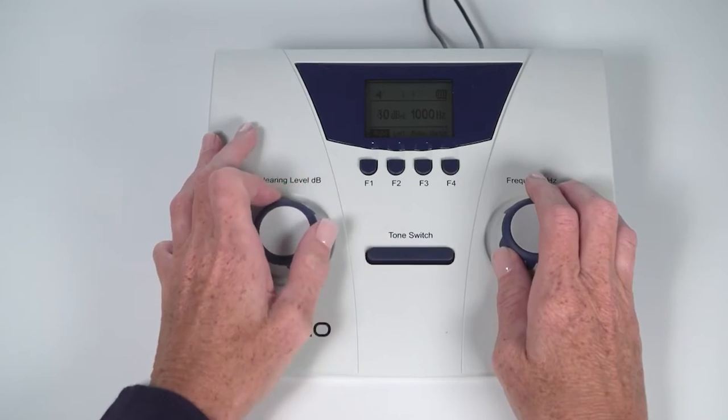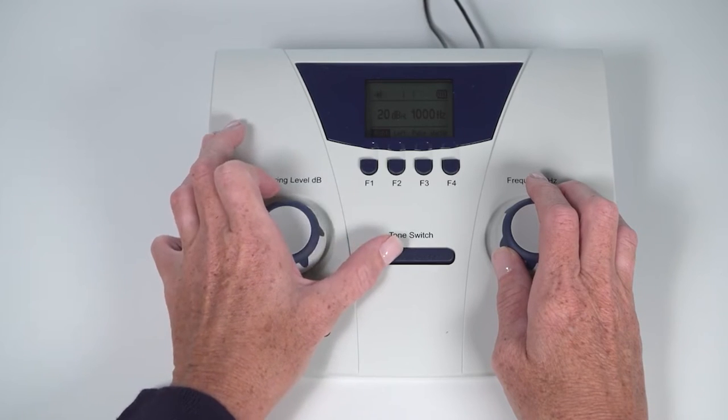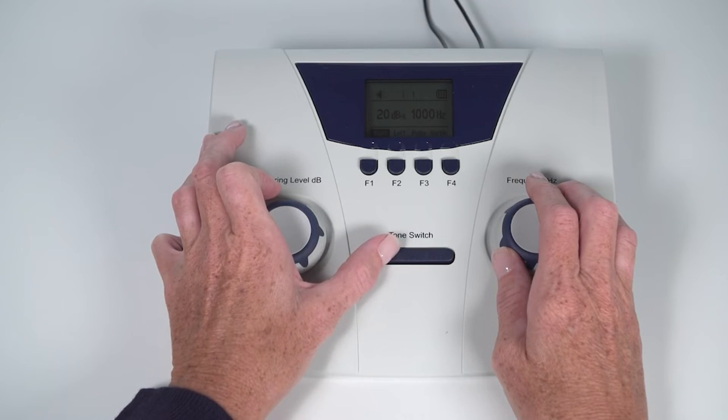When the child responds, lower the volume level to the screening level. This is usually 20 dB — present again. Once you start testing at the screening level, you have now started the screening test and the level should remain constant.